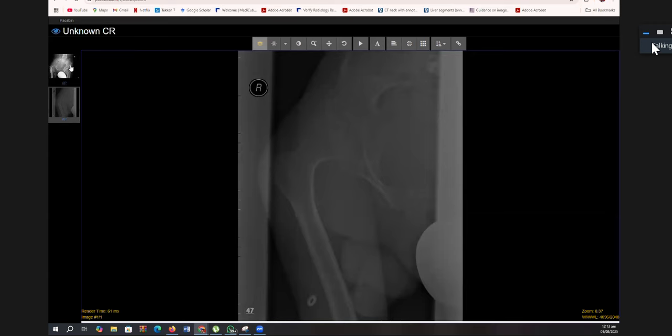I just want you to describe what's going on. First of all, tell me whether it's male or female, and tell me whether you know what the diagnosis is. Okay, sir.